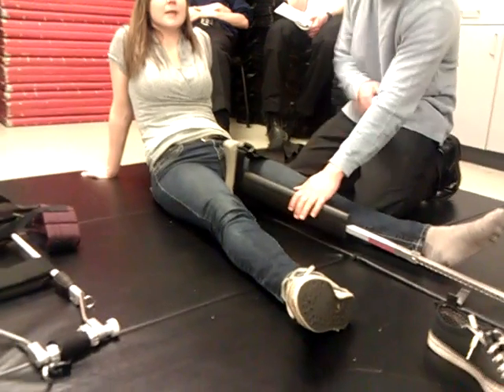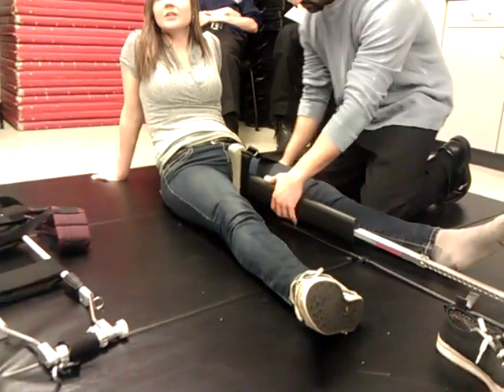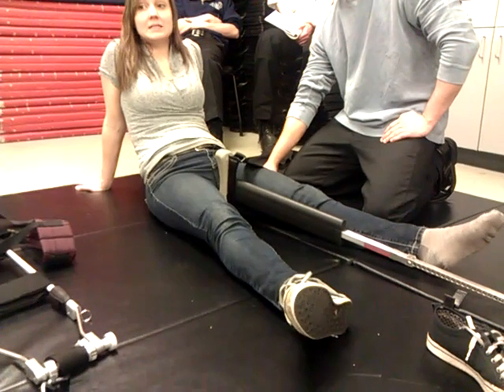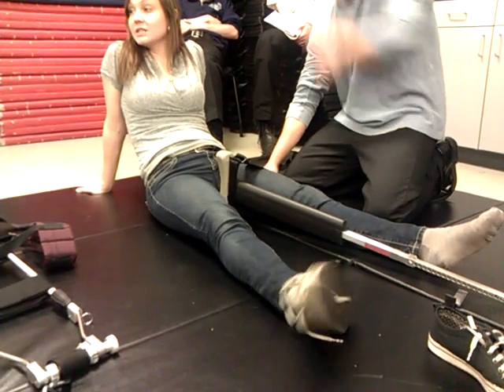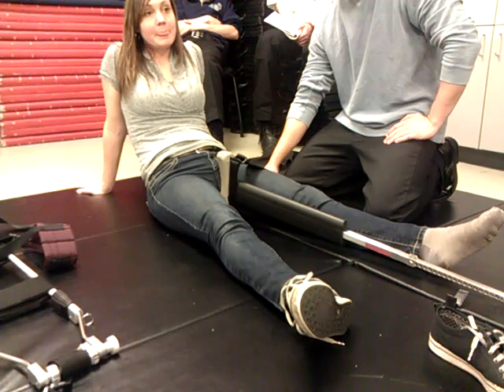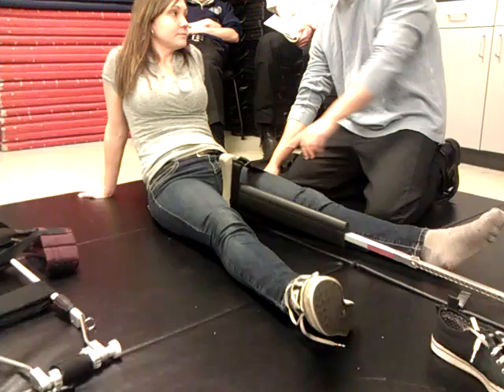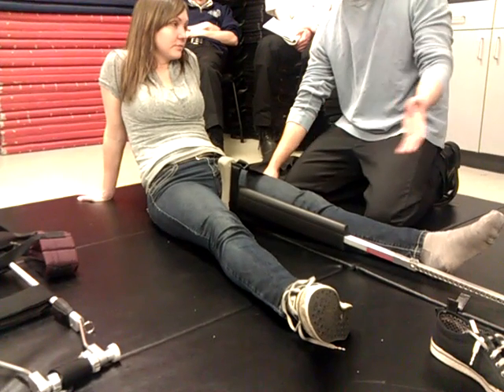It's a good time to do it. So just be sure that you're polite about it. Even in class, I know that you will get dinged and dinged hard if there is crass or foul language around this kind of activity. And again, this will still be manually stabilized because it's being stabilized from the very beginning.